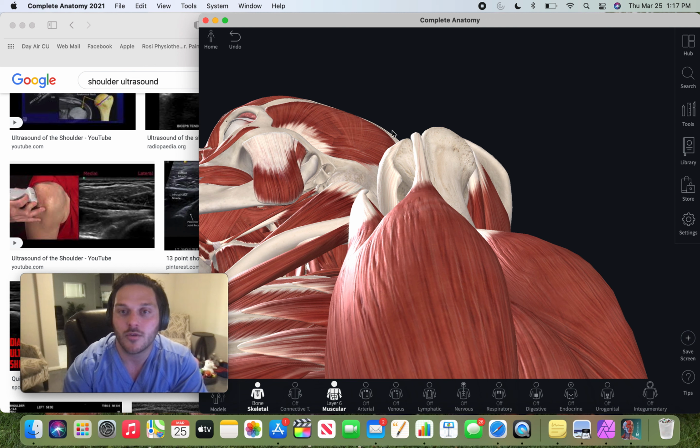And then we are going to have the muscles above. So you're going to have that subscapularis tendon, that's going to be residing medially or laterally, depending on which way you have your probe set. But that's why it's important to locate and designate your image so that you can give yourself a focal point. And then you're going to have the deltoid, which is cut so that you can provide this image to show you real quick. You're going to have the deltoid, subcutaneous tissue, subcu, and fat and skin. So that is kind of what that image looks like.